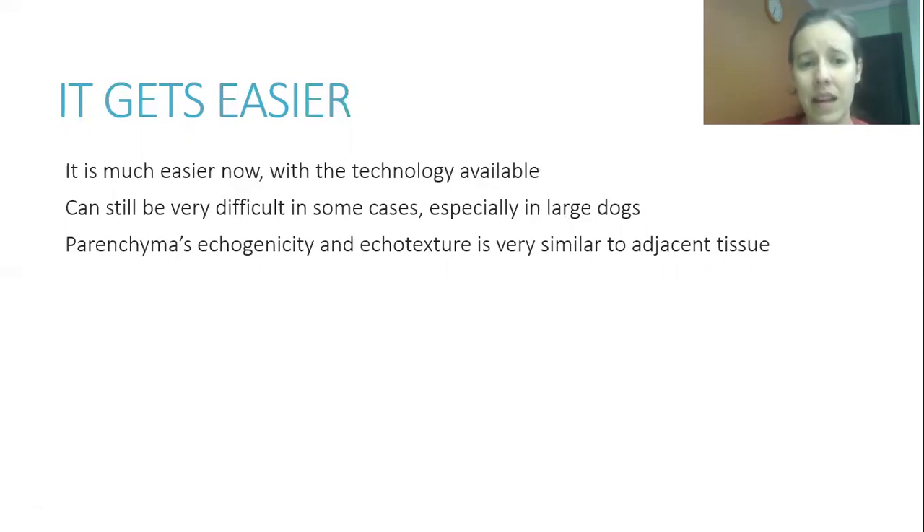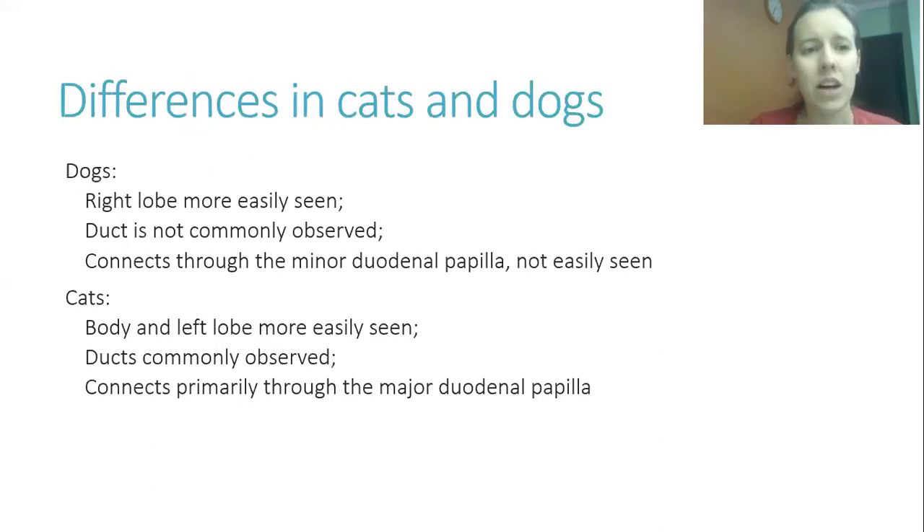The parenchyma echogenicity and echo texture of the pancreas is very similar to adjacent tissue. You have to be very patient and try to find that thin hyperechoic capsule to identify where the pancreas is. There are a few differences between cats and dogs that are worth noting.